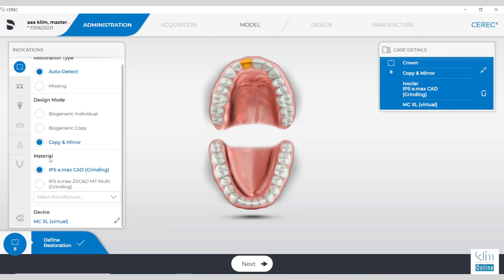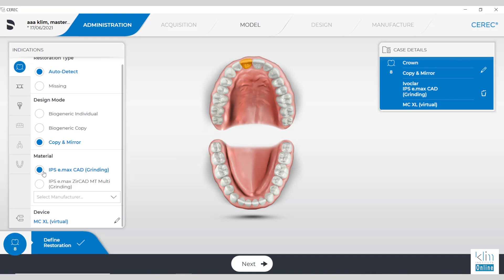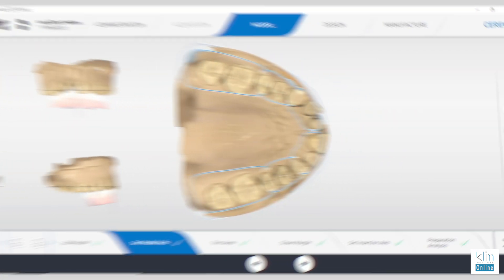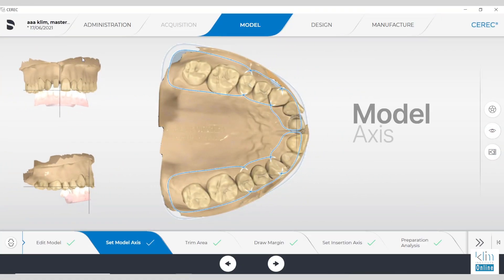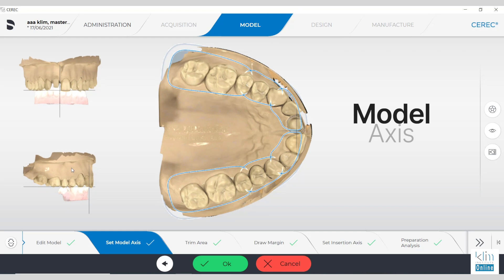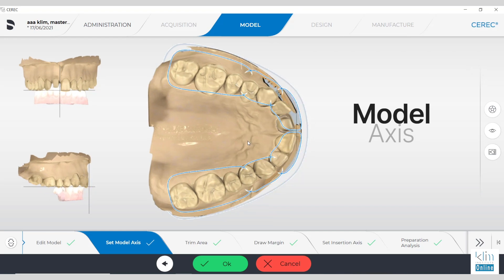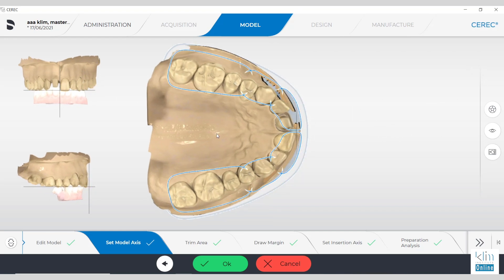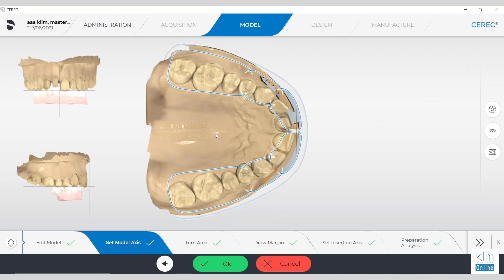Copy and mirror — one of the best features in CERC software. Set up your administration screen. Our first step in the model screen is to verify the model axis. This will set up the axis that we need for this anterior tooth. Midline is always number one, and the smile plane is second over that.